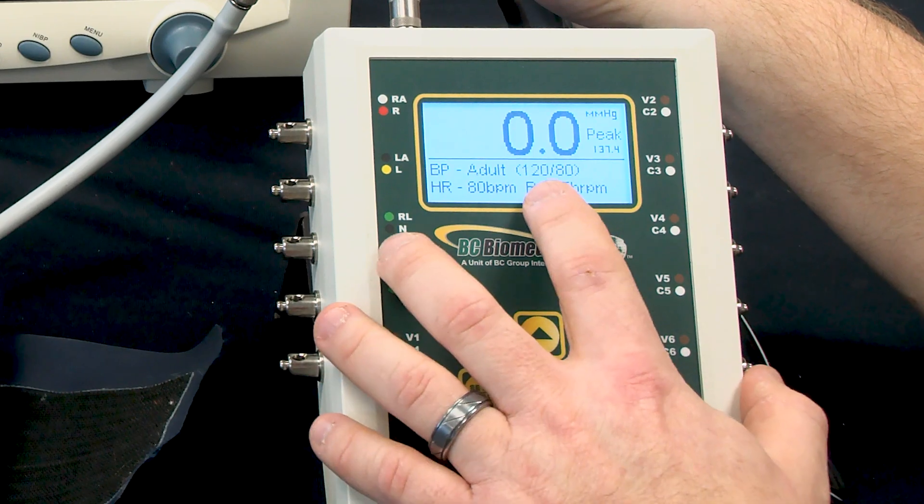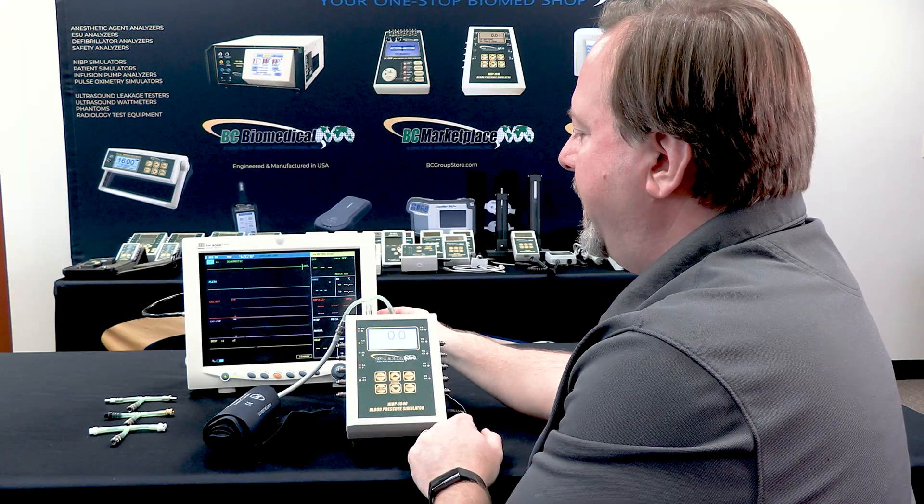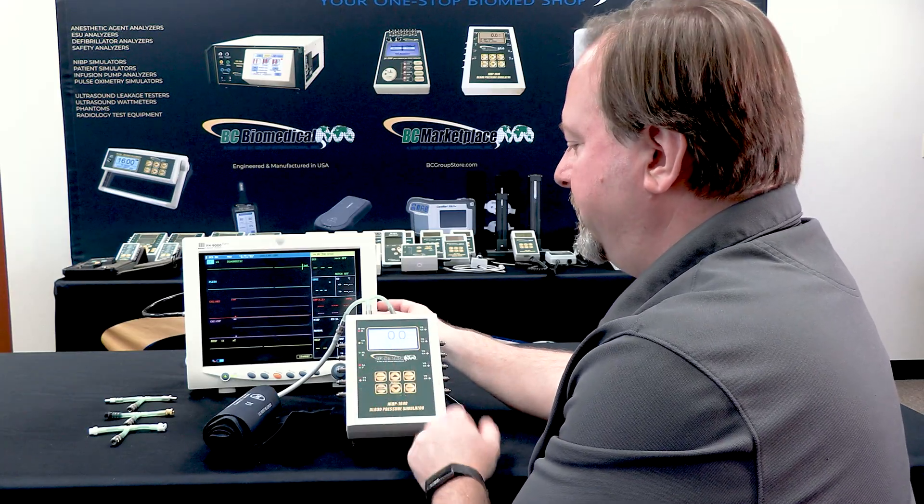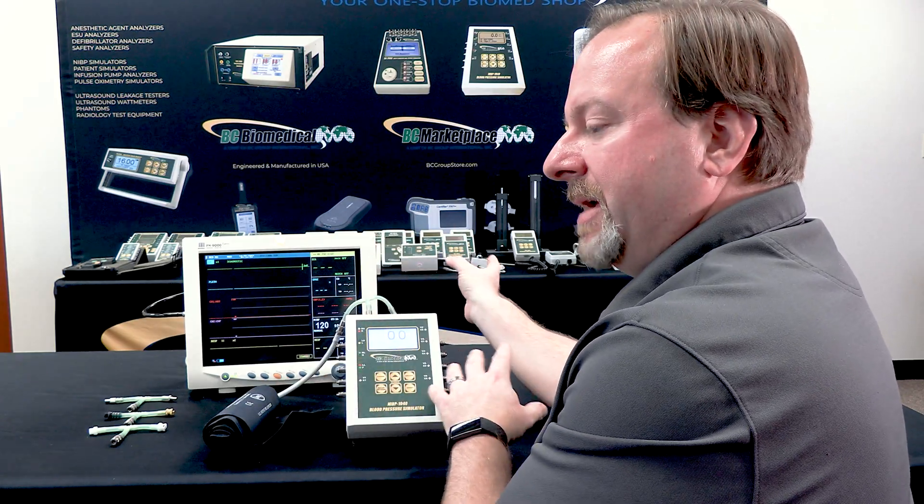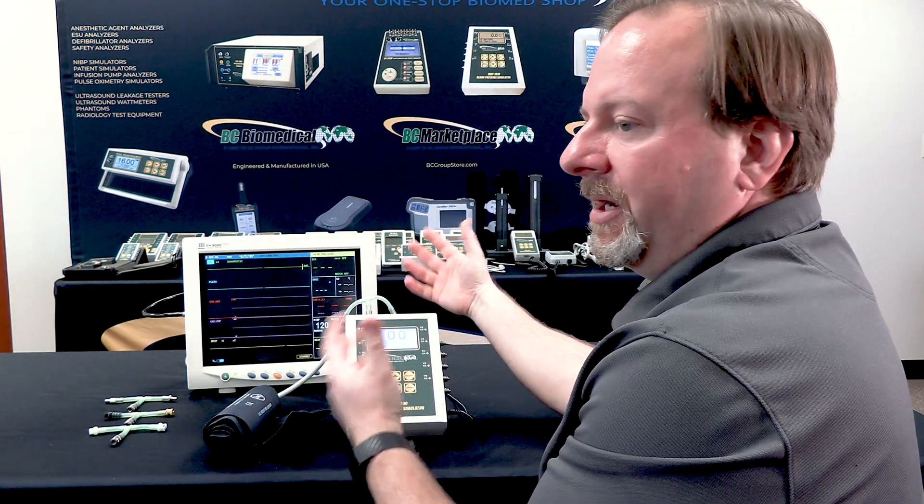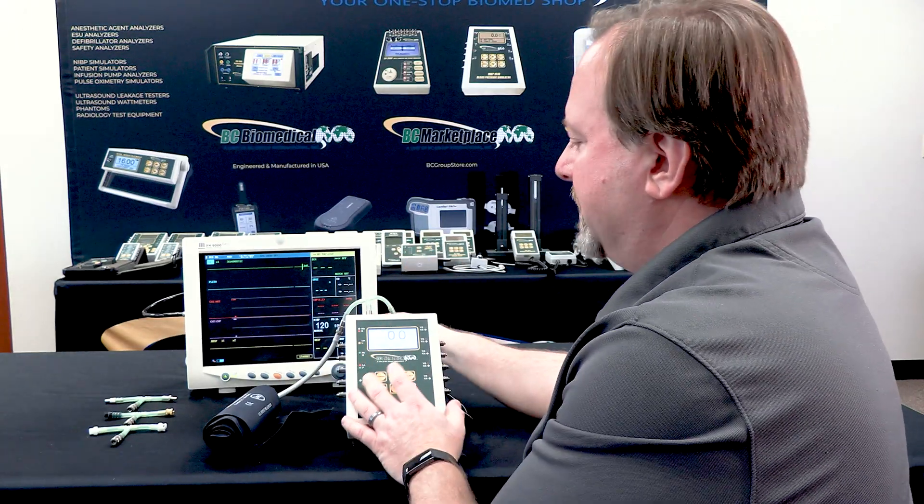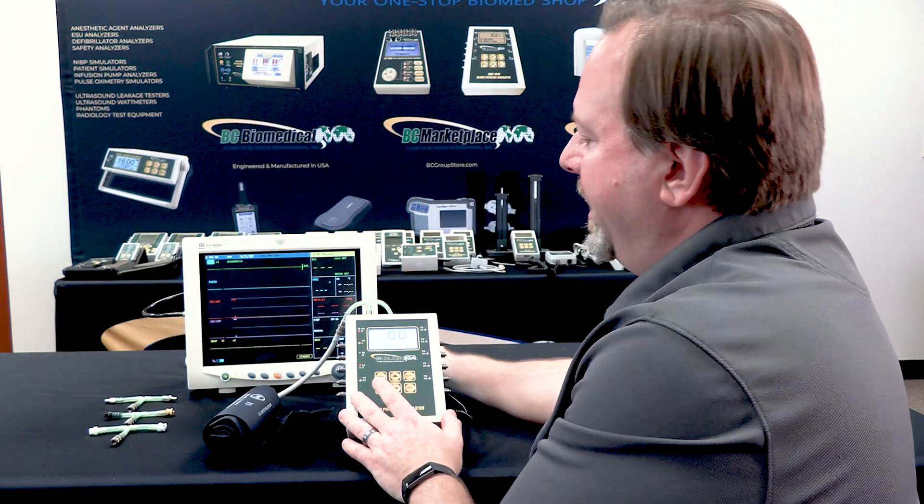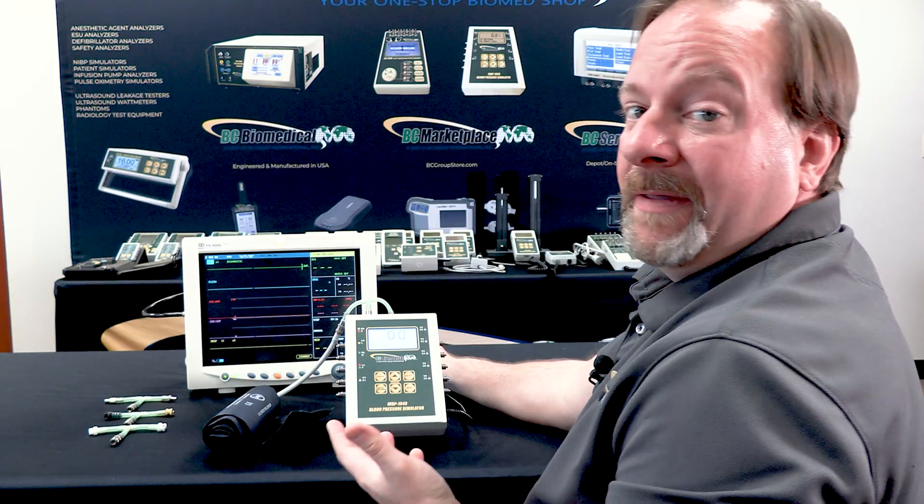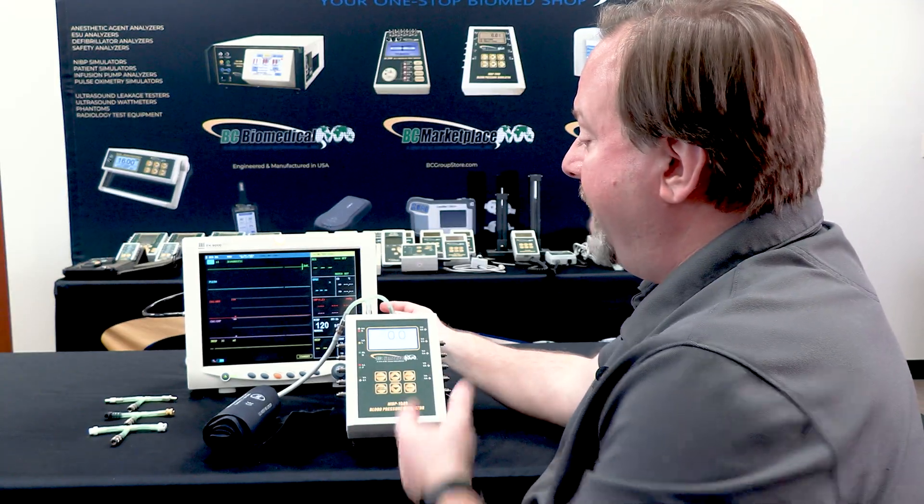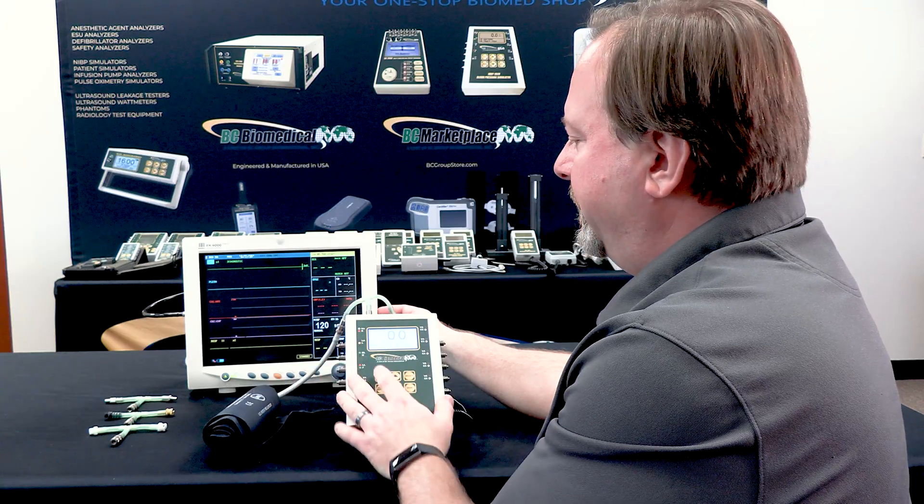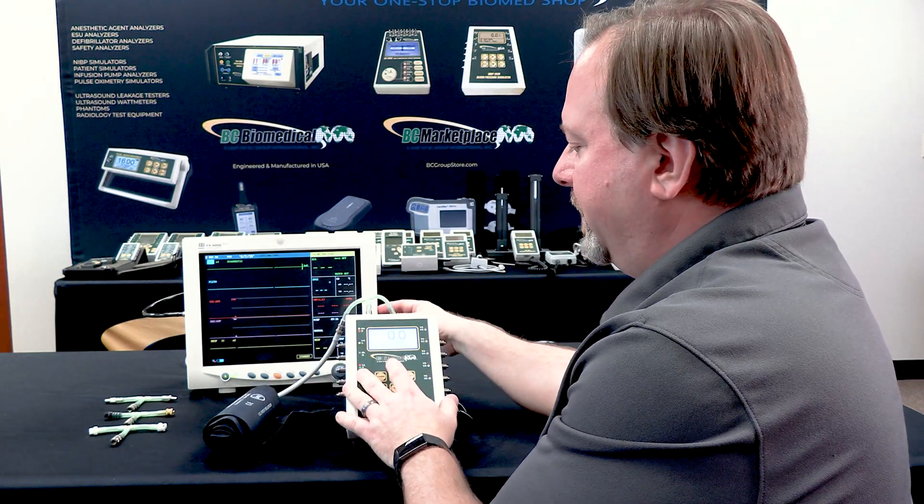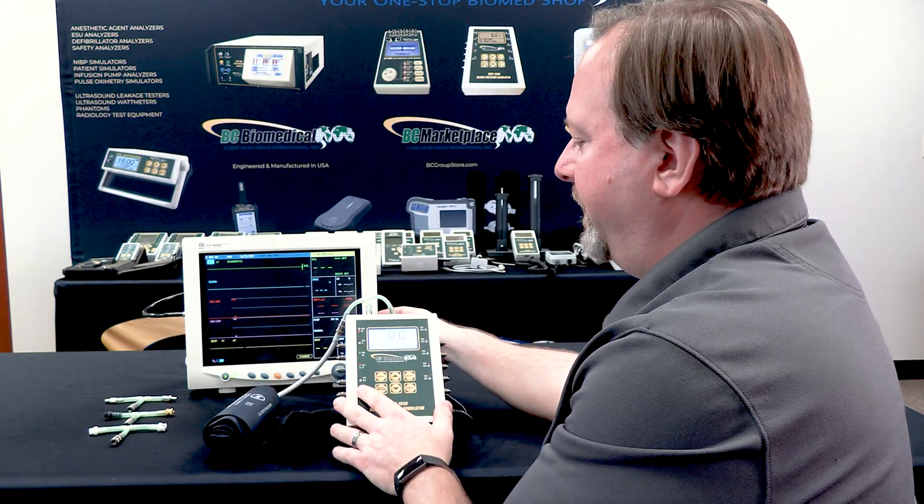In this case, it was 120 over 80 that was set, and we had 120 over 81 that was measured. Now all of the Mindray monitors should measure the same. The same goes for GE or Philips or whichever manufacturer you're testing. And you may want to have your measurement match exactly what you're simulating, so you may have a set of offsets for each particular manufacturer.